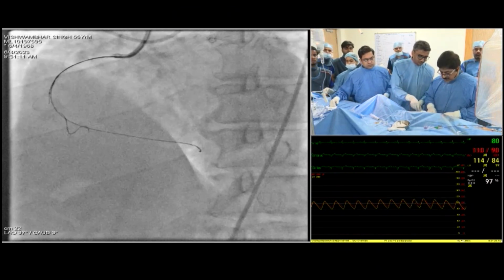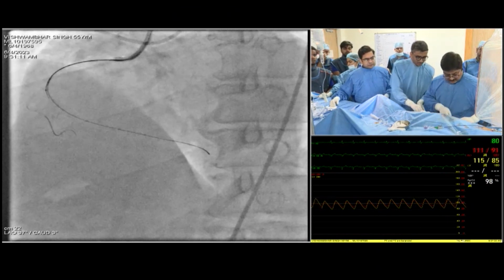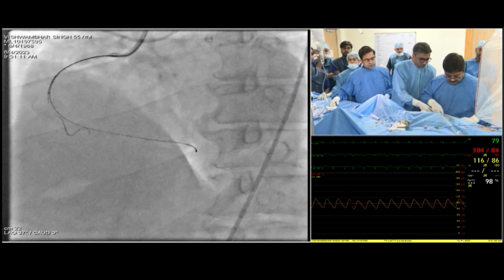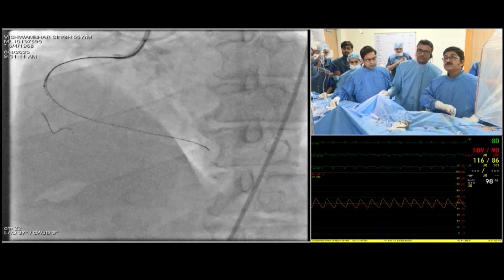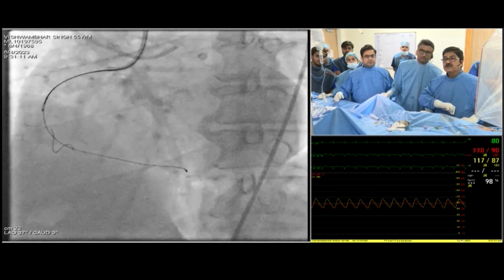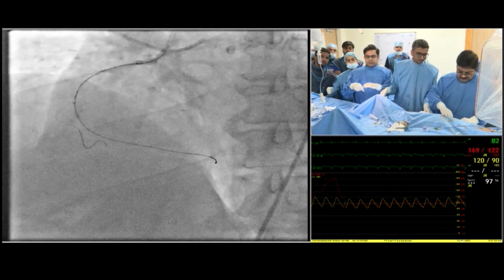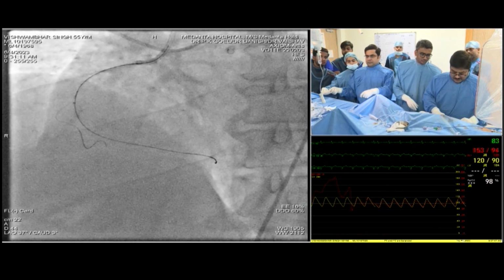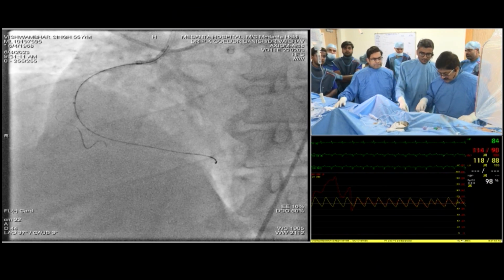Dr. Goel, Vivek Gupta, I should compliment you. You have shown a very step-by-step approach to all the audience sitting here, especially when the side branch is stuck and has to be taken out. Okay, thank you very much. And we would like to go to another room. A big congratulations, Dr. Goel.